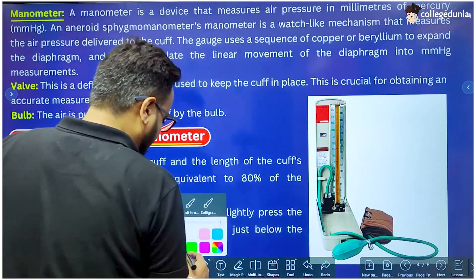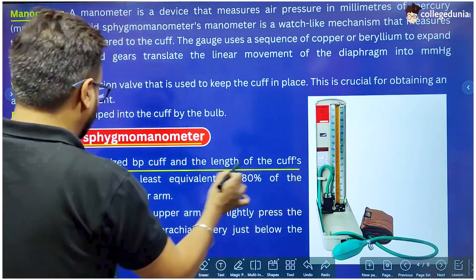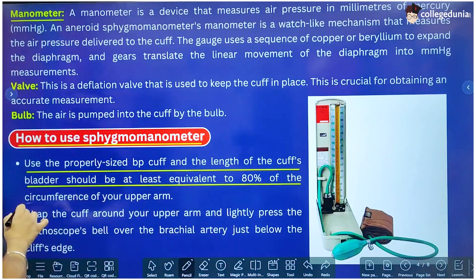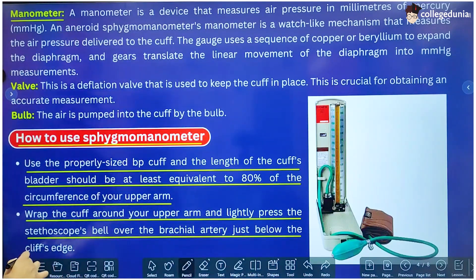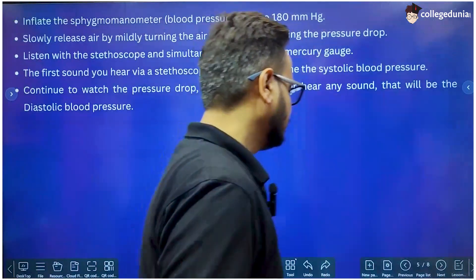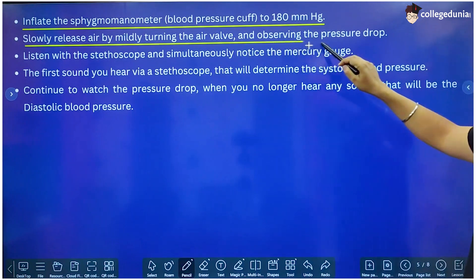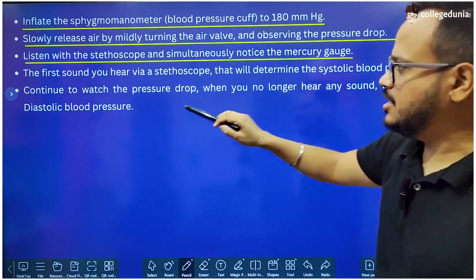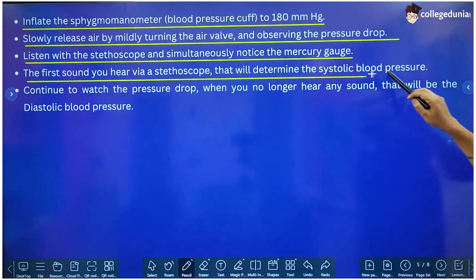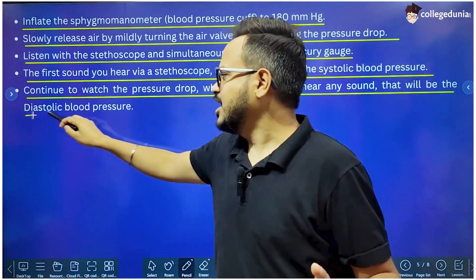Here are the steps: Use a properly sized BP cuff — the length of the cuff's bladder should be at least 80% of the circumference of the upper arm. Wrap the cuff around the upper arm and lightly press the stethoscope's bell over the brachial artery just below the cuff's edge. Inflate the Sphygmomanometer to 180 mm Hg. Slowly release air by mildly turning the air valve and observing the pressure drop. Listen with the stethoscope and simultaneously watch the mercury gauge — the first sound heard determines the systolic blood pressure. Continue watching the pressure drop; when you no longer hear any sound, that is the diastolic blood pressure.